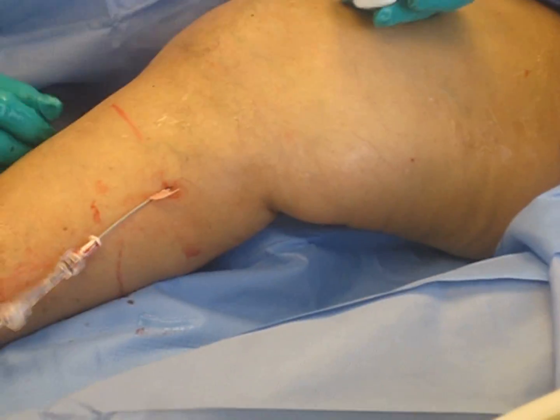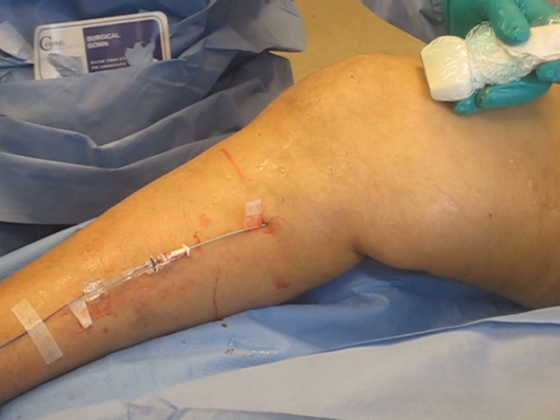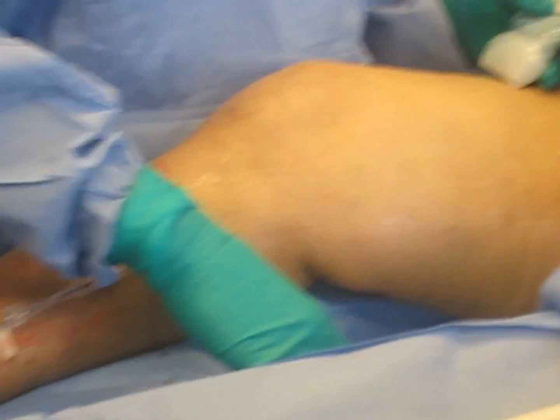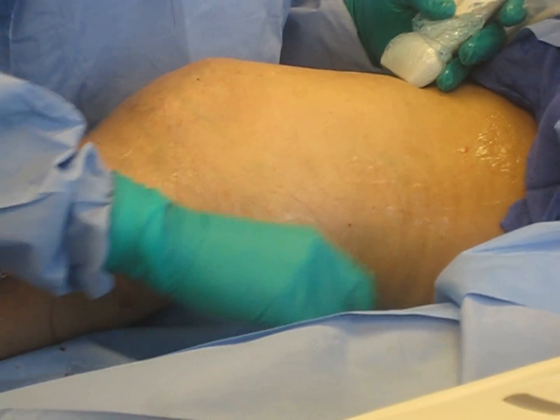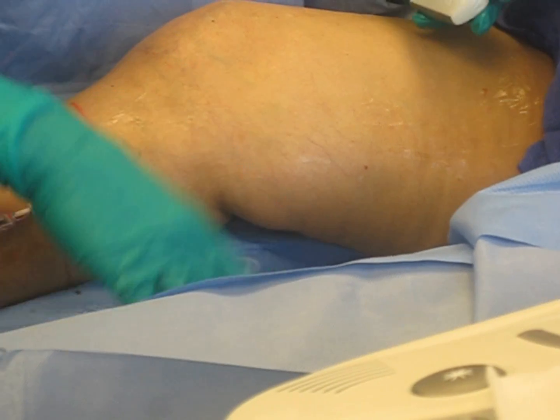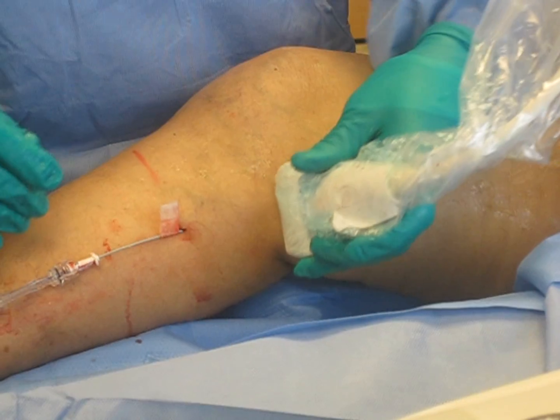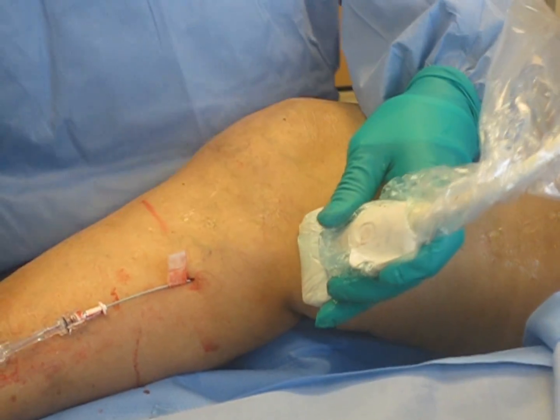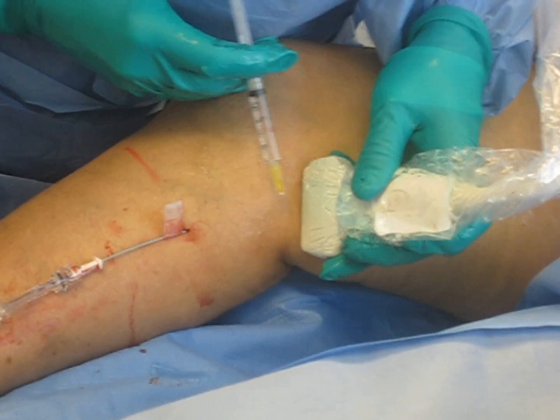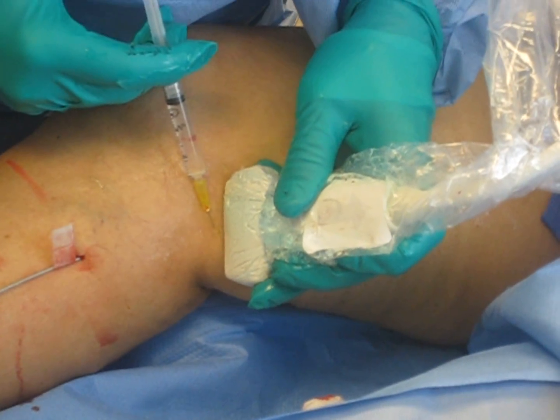Nancy's just going to anchor that. Our next step, which probably takes the longest, is actually pumping the local tumescent anesthesia around the vein from top to bottom. I'm going to do some little superficial numbing here — she's going to feel about four little pinches. One right about here — trying my little mosquito technique. She's a little sensitive today.